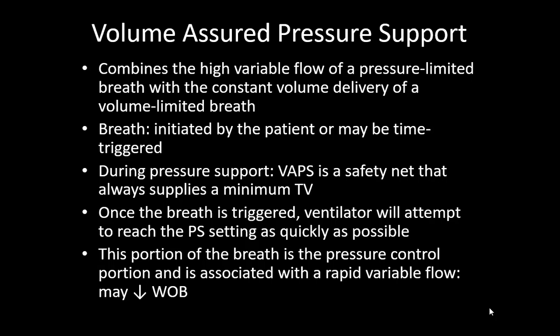Volume assured pressure support combines the high variable flow of a pressure limited breath with the constant volume delivery of a volume limited breath. So in a volume limited breath, we give a constant volume delivery, and in a pressure limited breath, there is a high variable flow.